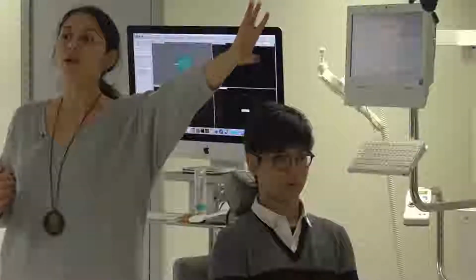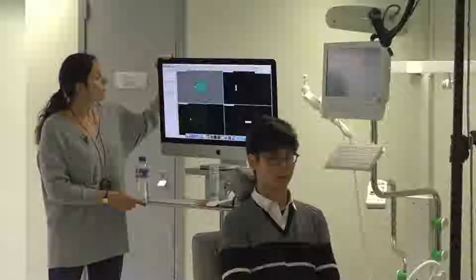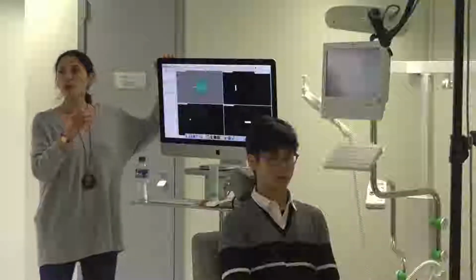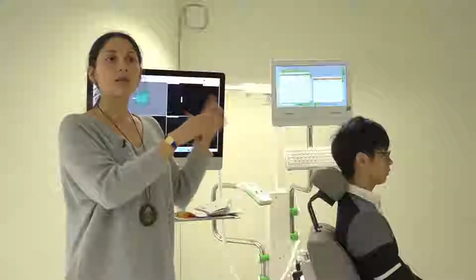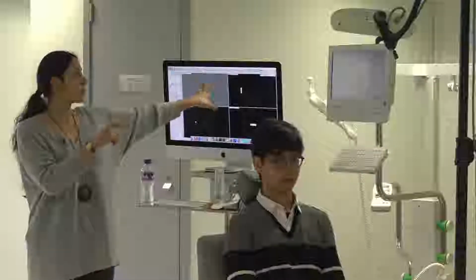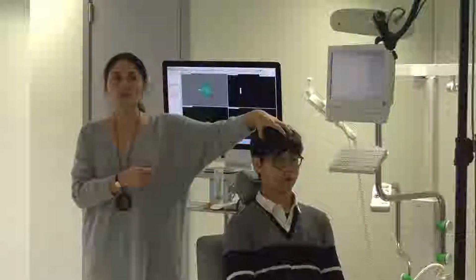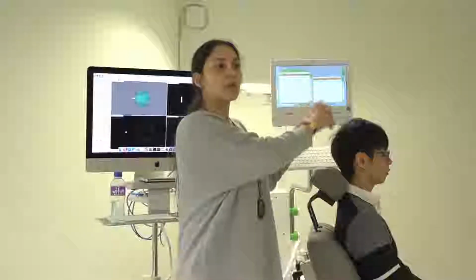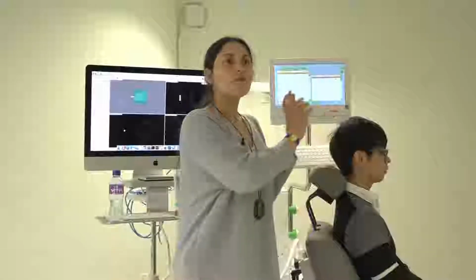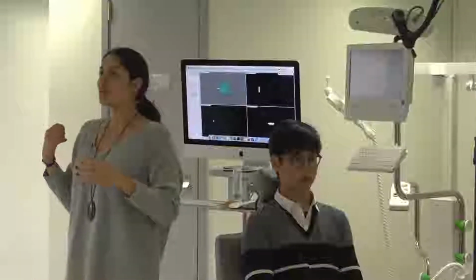This is a camera, connected to this computer, and this software is the brain side. It allows me to locate different regions in the brain, and I can keep my coil steady. I will put some sensors on the head of my lovely assistant and on the coil, and then I will always be able to locate my stimulation site. For motor cortex, it's not needed because you can see that you are stimulating. It is mainly needed for other regions because you don't know where you are.